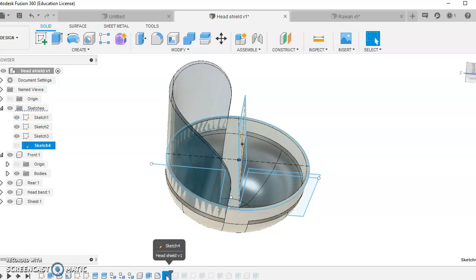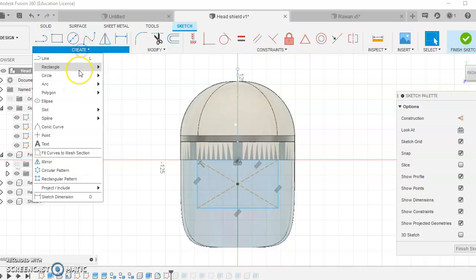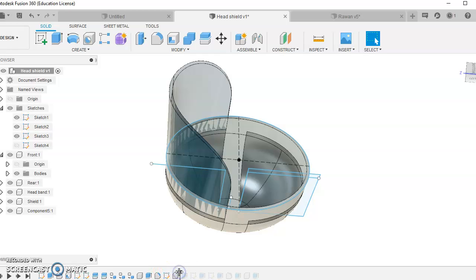I did another sketch, and on this sketch I've sketched the window. So I used a center rectangle, and I took a measurement from the top of the forehead down to the center of the eye level. Then I brought that out to a distance of about, I think it was, 150. So with that, you've got a window, you've got the width, you've got a good viewing gallery, and that's going to be your interactive screen. Okay, good. We move on again.